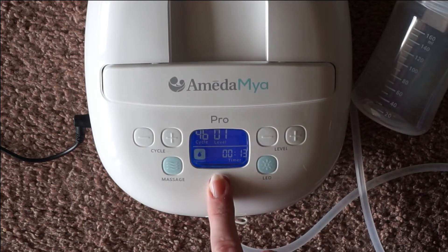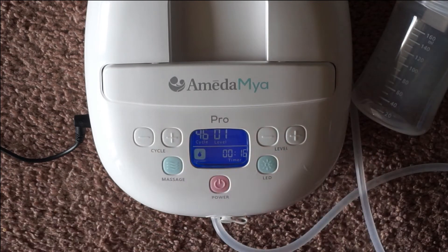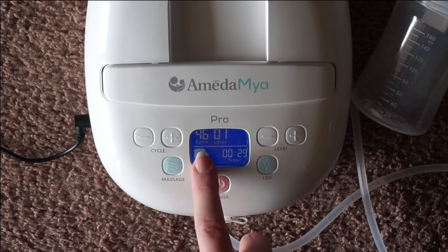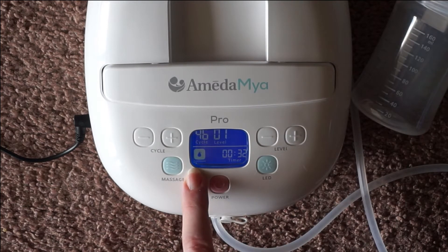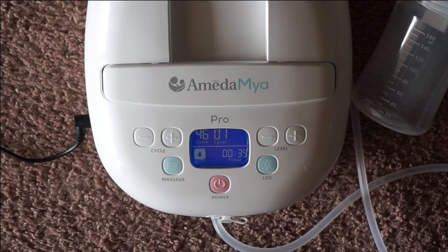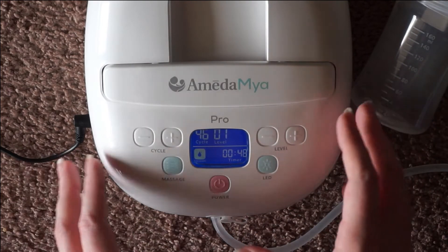For someone who uses lower settings it's not that big of a deal, but for someone who slowly increases throughout their pump session, it is going to be a big deal. It does have an LCD light-up screen that's going to tell you what cycle you're on, what suction level, if you're in massage or expression mode, and also a little timer. It does have a 30-minute timer, so it'll shut off then — that doesn't mean you did anything wrong, it's just there as a reminder that it's been 30 minutes, and also in case you fall asleep.